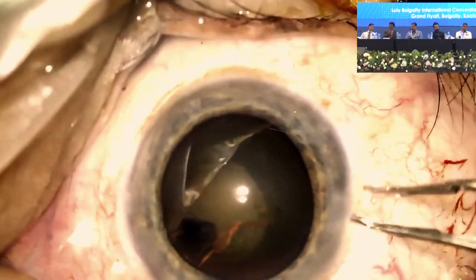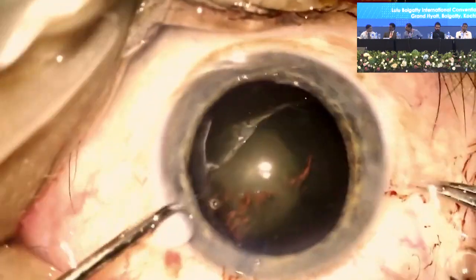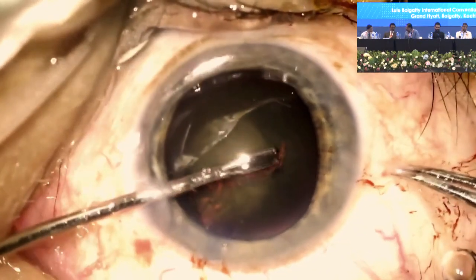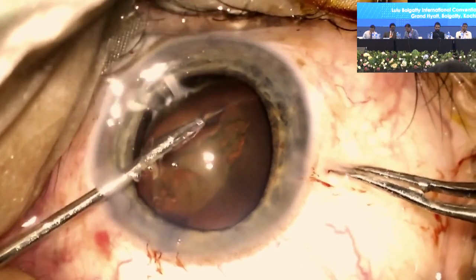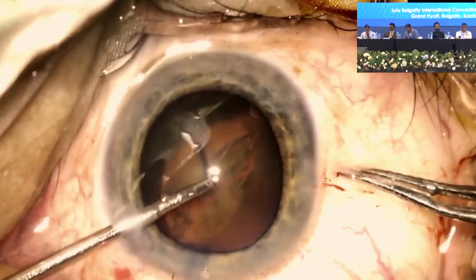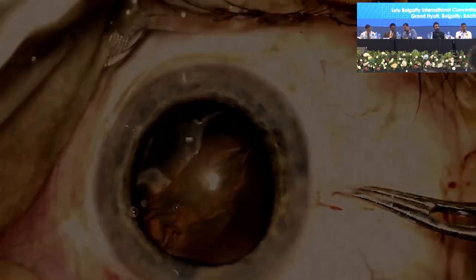You will now notice that you do have an intact rhexis, however, it is eccentric. Therefore, it is now enlarged. In order to do so, I make a tangential nick in the anterior capsule, hold on to that tear, and enlarge it suitably, thereby giving me a resultant opening, which is comfortable to perform safe phacoemulsification and the implantation of an IOL in the bag.